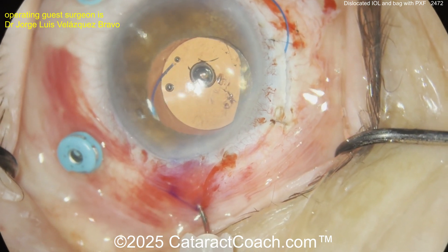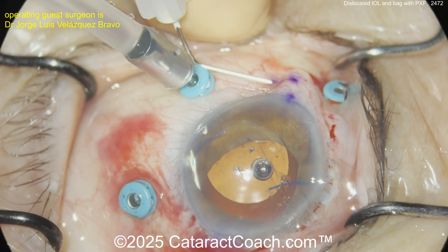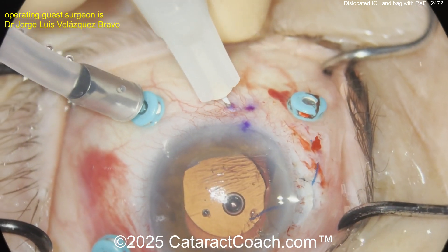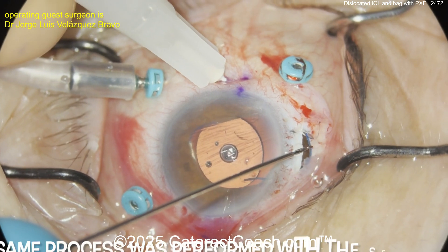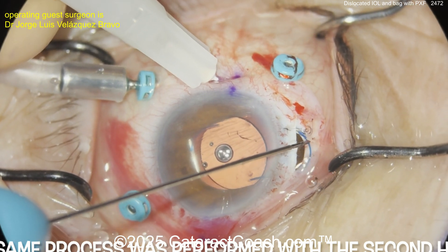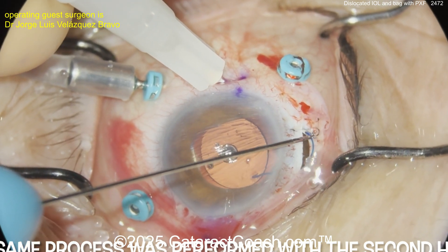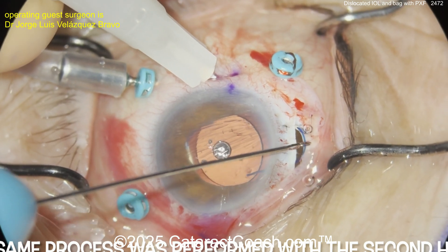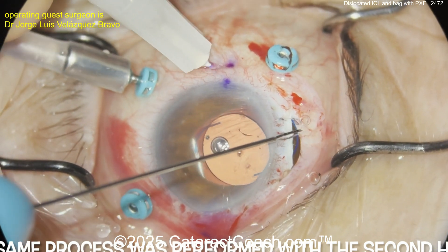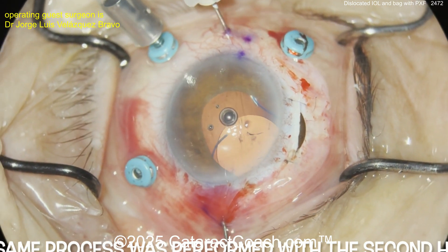The other needle going in on the opposite side — again a two-millimeter tunnel in the sclera, two millimeters posterior to the limbus. Now entering the eye, and you can externalize that needle; it's a lot easier to thread these haptics in that hollow-bore needle outside the eye. Look at the optic — it stays parallel to the iris, you don't have the optic dipping down into the mid-vitreous, which is important. Remember, sometimes you'll have a higher incidence of cystoid macular edema in these patients if you get vitreous trapped up in the haptics. You don't want that. Now externalize that needle — two haptics outside the eye, beautiful.